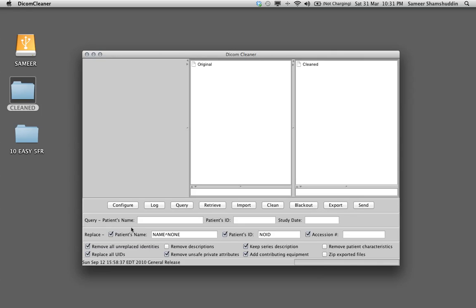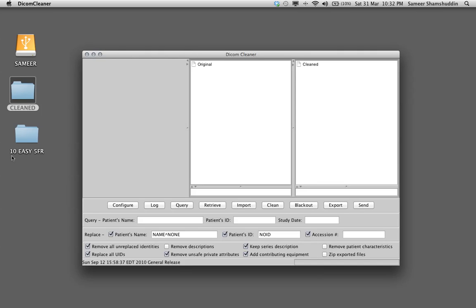Let me just make you familiar with this by doing a live case. On my desktop you can see that there are three icons here. One which says Sameer which is my external hard drive. Another which is cleaned, that is a folder that you need to create in order to export the cleaned cases. And this is a case called 10EZ5FR which needs to be cleaned.